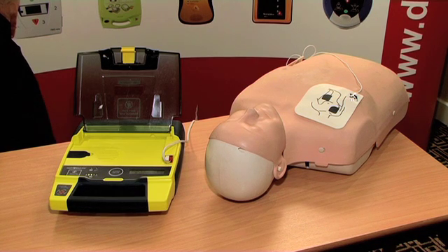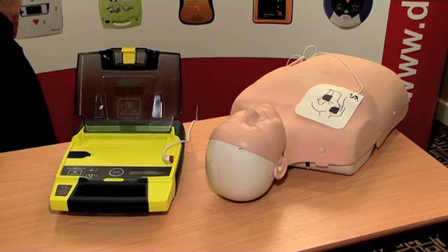It is now safe to touch the patient. Give 30 compressions, then give 2 breaths. Start CPR.